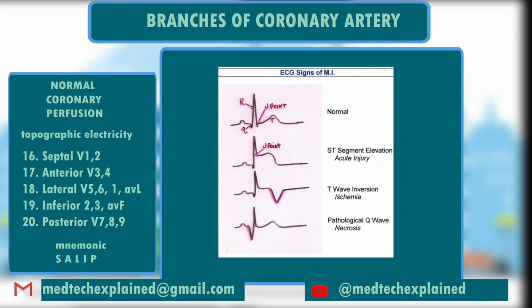Now, what are these leads trying to detect? What are we looking for in these groups of leads? Well, we are looking for abnormal patterns in the Q wave, or the ST segment, or the T wave. But first, let's see some definitions. Let's start with the Q wave.